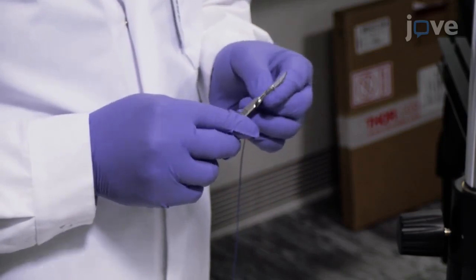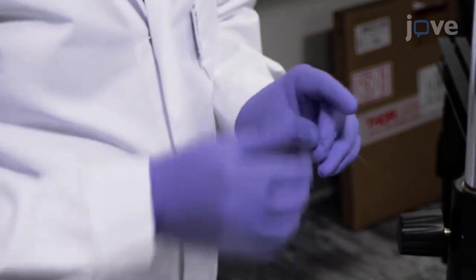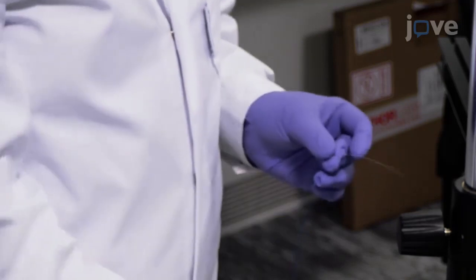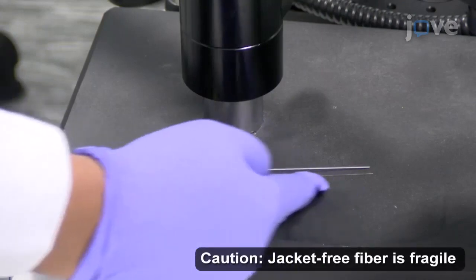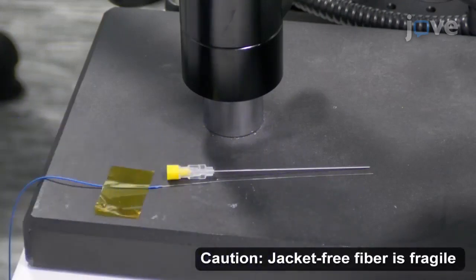Using a scalpel, partially remove the 900 micrometer jacket along the length of the fiber optic hydrophone close to its distal end to expose the buffer layer until the hydrophone can fit within the needle cannula.